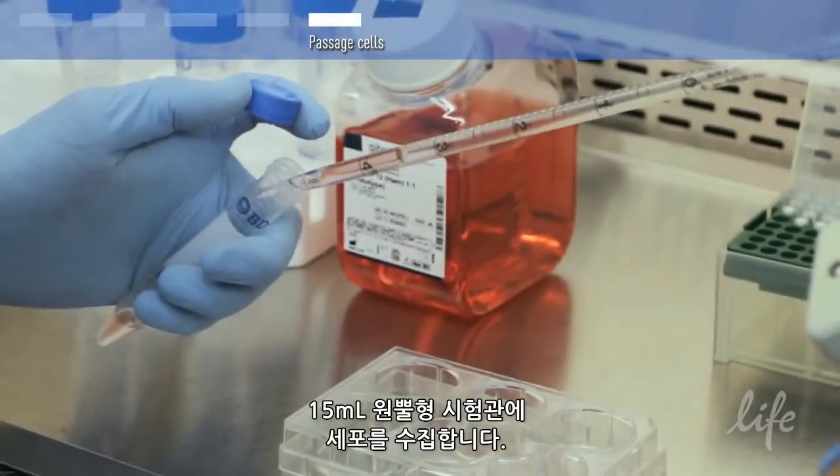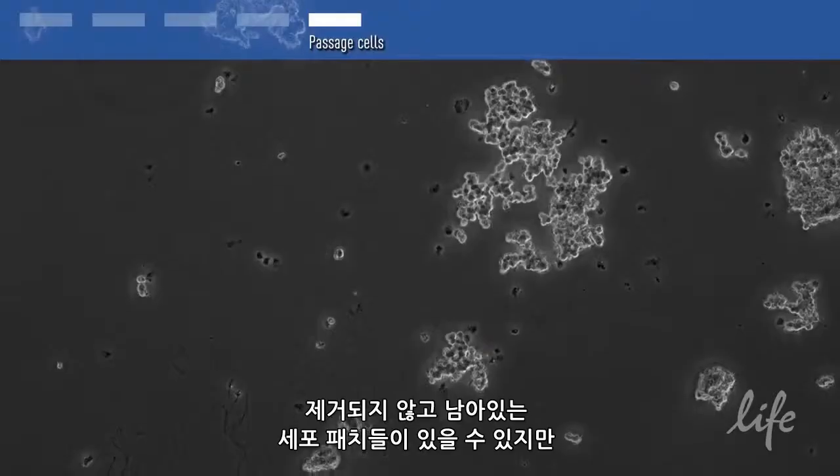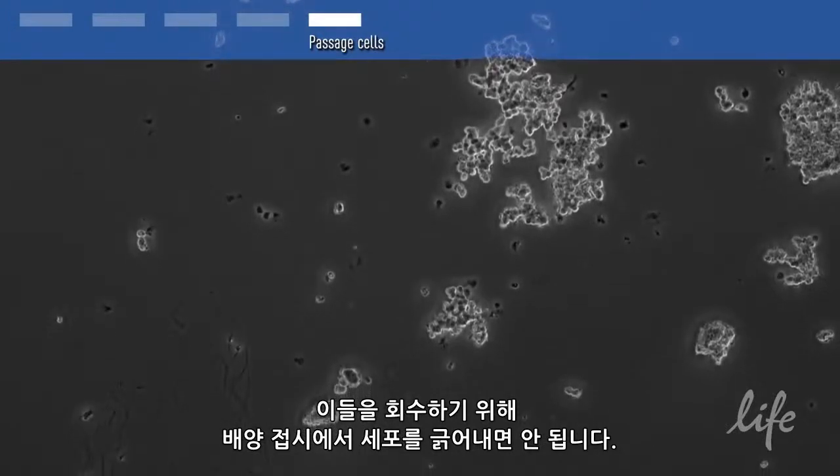Collect cells in a 15 ml conical tube. There may be obvious patches of cells that were not dislodged and left behind. Don't scrape the cells from the dish in an attempt to recover them.